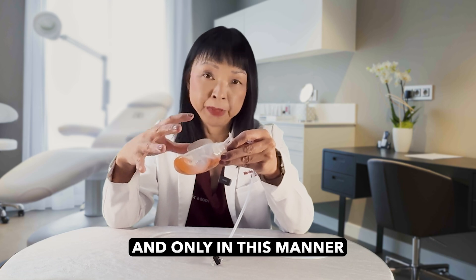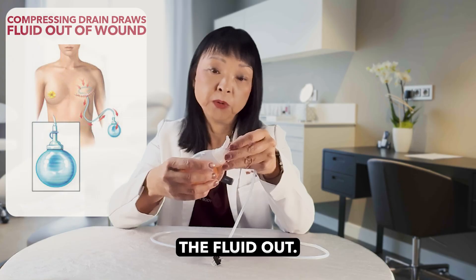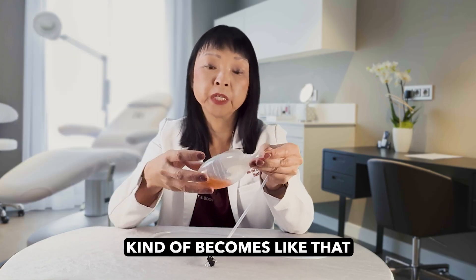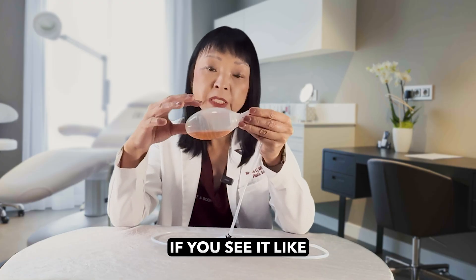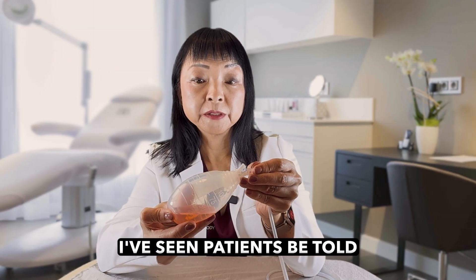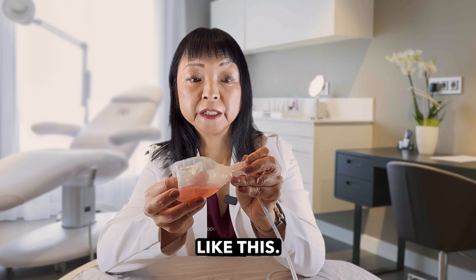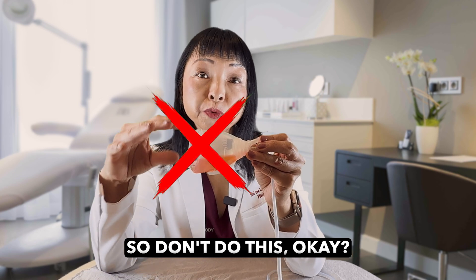Only in this manner is it giving what we call negative pressure and drawing the fluid out. When it fills up, it becomes poofed up like this. If you see it like this, it's no longer holding suction, and it's really important that you empty it and compress it again. I've seen patients told to charge the drain by pushing it in like this — this is not very effective, so don't do this.